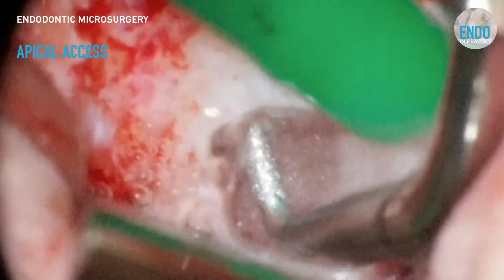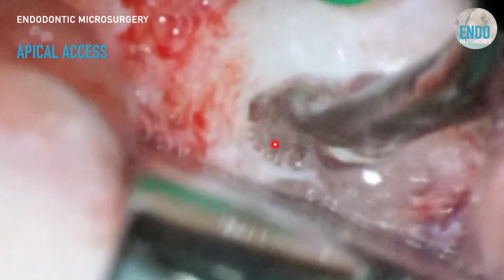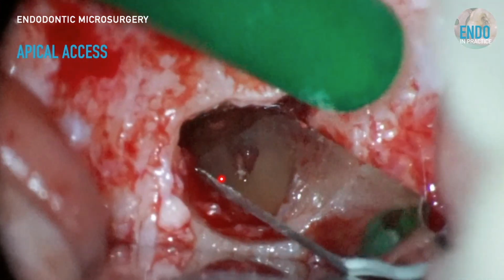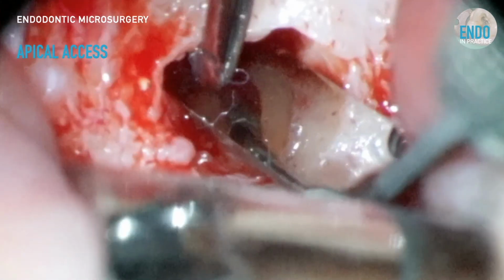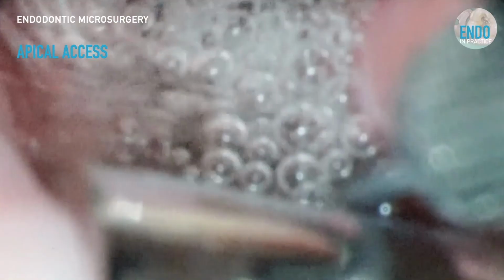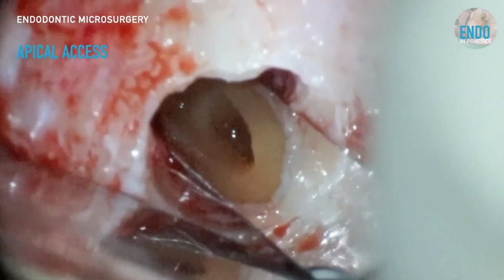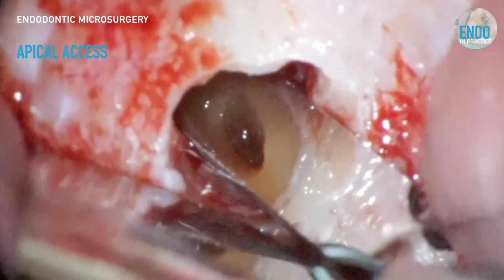Again, with ultrasonic instrumentation, you need enough access to get that actually into the canal. So sometimes you do have to increase the size of your osteotomy slightly. And you will always leave a little bit of labial GP. It's notorious because you lose your orientation with the ultrasonic. It's very easy to leave that. So with your micromirror, you can see how it pops out nice and easily, and you know that you've resected the GP back by at least 3mm equally down into the canal.